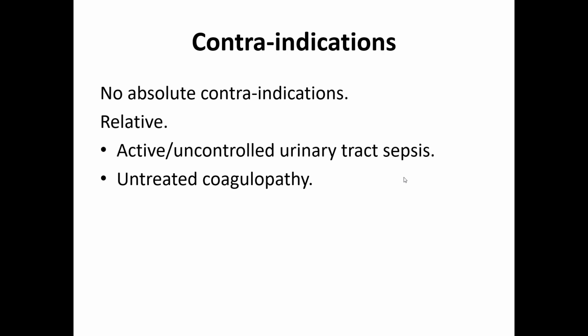We all know that this procedure is done usually under image guidance, usually fluoroscopy. You puncture the femoral artery. There is a special guide wire, and after you follow this guide wire, you put your cannula, a special type of catheter, and then you visualize the aorta, the kidney and the renal artery, and you go to the targeted vessels, and then you embolize.